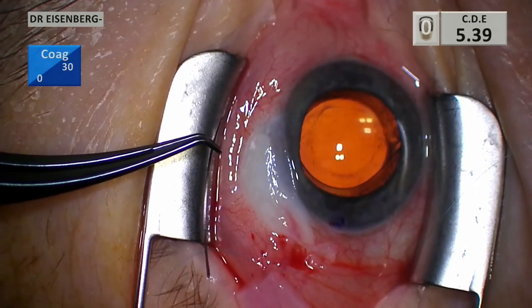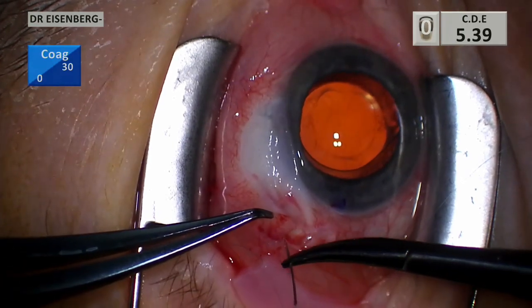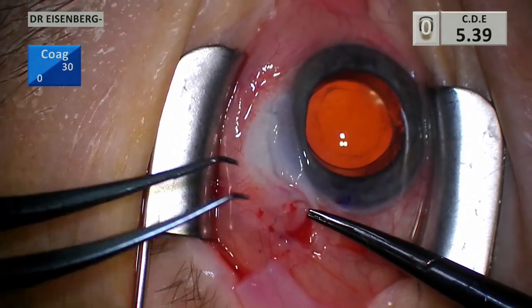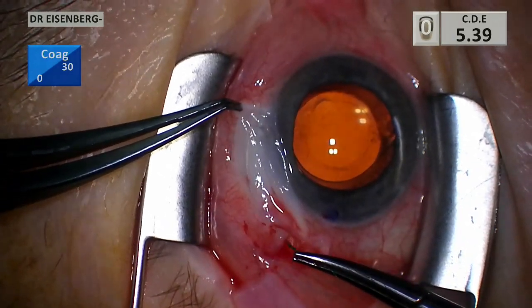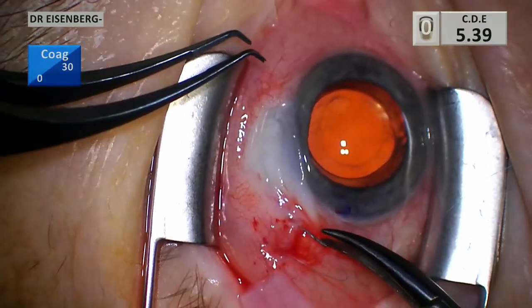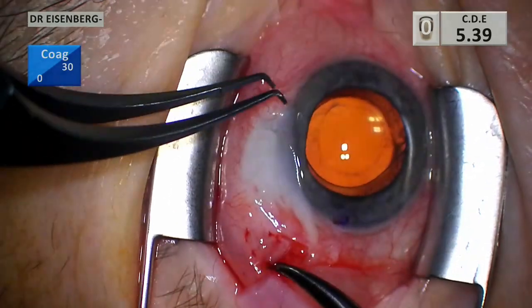Here I'm putting a little bit of viscoelastic into the bleb. I don't always do this, but in this particular case the bleb was collapsing to the point where I didn't think I was going to be able to make this pass. The goal is to pass it through the tissue clean without getting caught into anything, and then come out in vascular tissue on the other side. It's super important: you go from vascular tissue at the radial wound to vascular tissue on the other side — we don't want to be sewing any of the ischemic bleb.